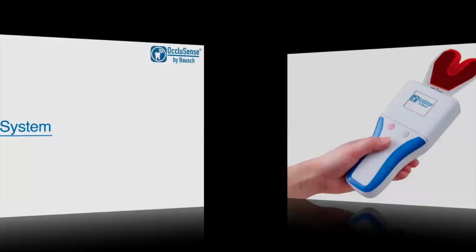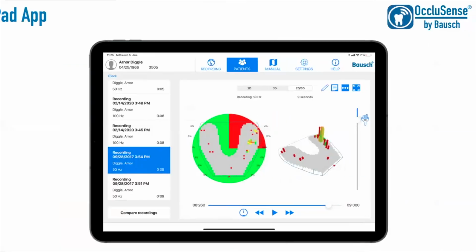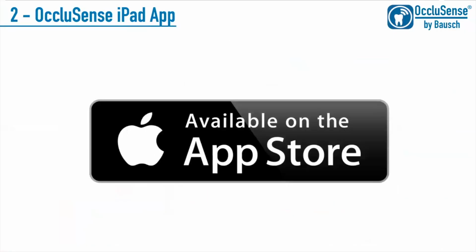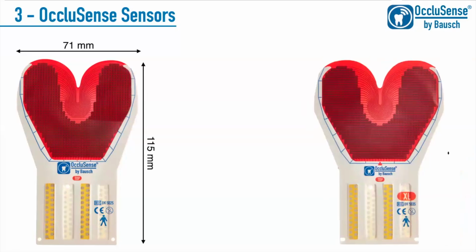The system, as you saw, consists of the OccluSense handheld. You need an iPad produced after 2014, and the OccluSense app, which is available for download on the Apple Store. What you will also need are sensors. So currently available, we have X and XL sensors. They differ in width rather than length.